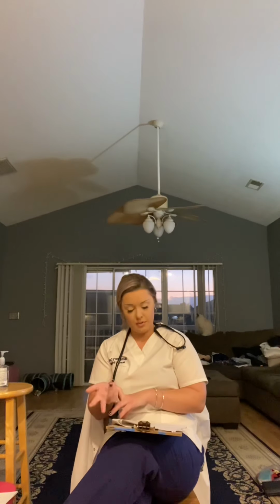And as I'm assessing their pulse, I also will stay there to assess their respiration rate. And while my fingers are still in place, after counting the pulse rate, I would observe the patient's respirations. I would note the rise and fall of the patient's chest, assess the depth and rhythm of the respiration. And I would have gotten 8 breaths over a 30-second period, times 2 would be 16 breaths, which is within the normal range. I would then go to assess the blood pressure.